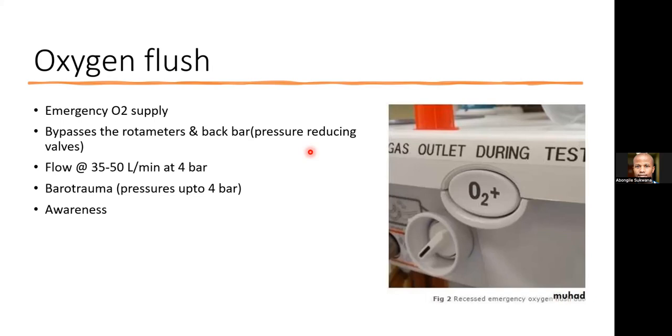There's no need for that. You can just go up on the flow until the bellows start moving again and they're full. Then you can start to come down again on the flow. Some people also talk about it if you bag mask a patient that is a difficult airway, then you can consider using it. But generally, I try to run away from it for these reasons.